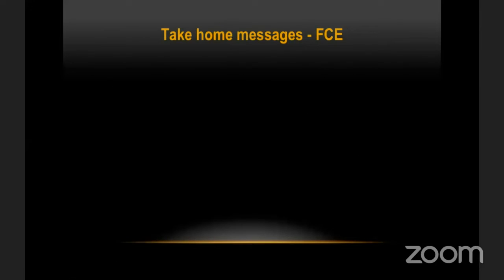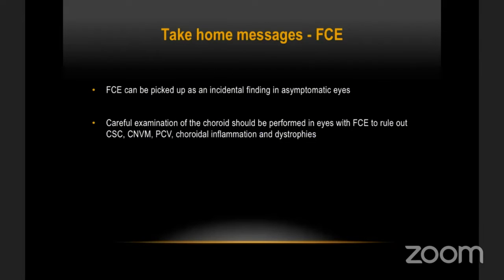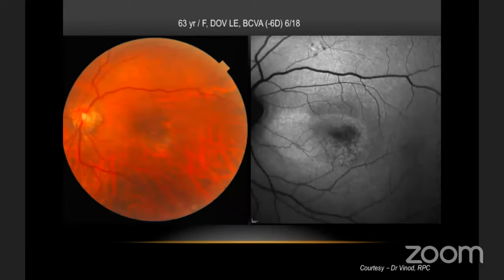So the take-home messages about this entity are that it can be picked up as an incidental finding in asymptomatic eyes, but you must carefully examine the eye and the OCT to rule out CSC, CNVM, PCV, inflammation, and dystrophies. Now, presence of an associated FCE does not alter the prognosis or treatment, and we are yet to understand the clinical significance of this entity.